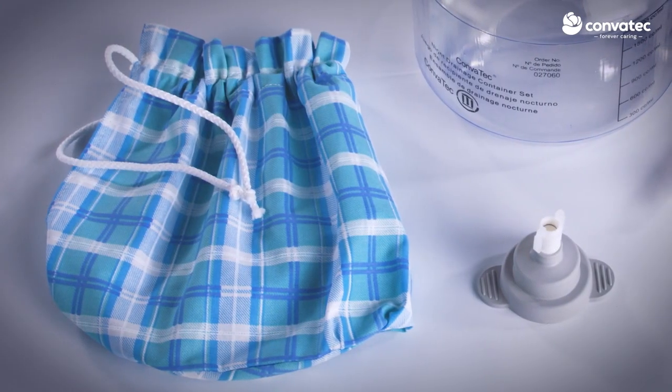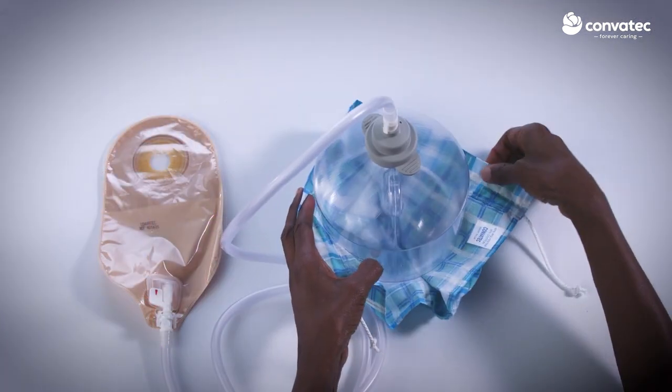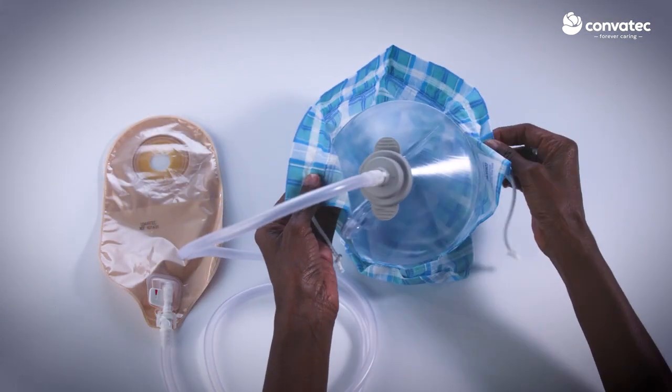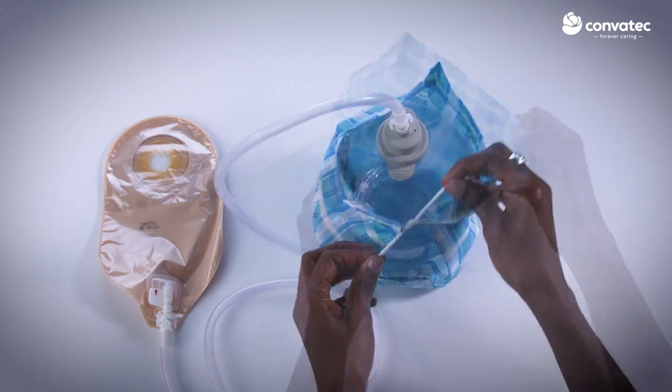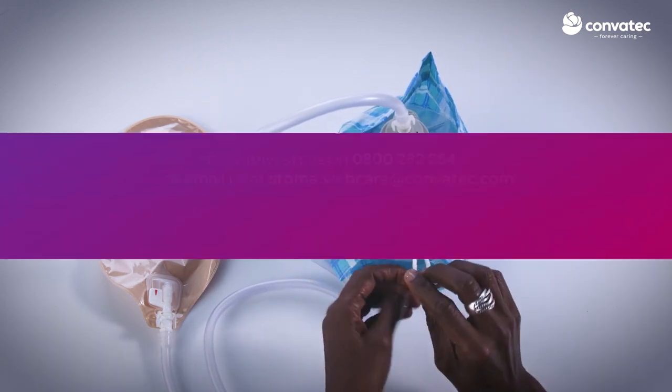Included with the system is a cloth covering for discretion. Simply lift the container and slip the cloth covering on, starting at the bottom. Tighten the drawstring and tie together to cover the container.